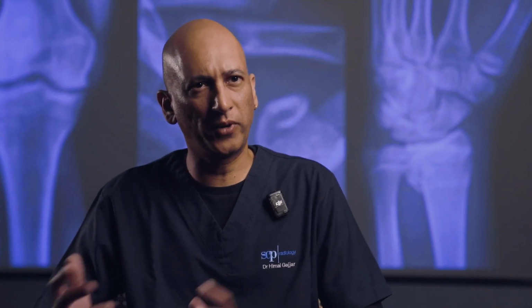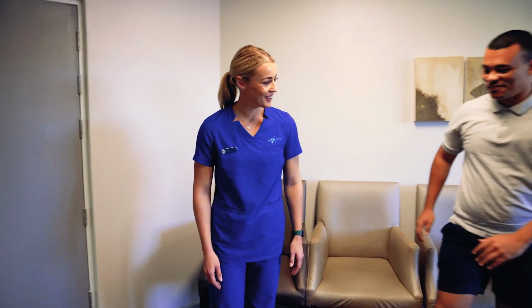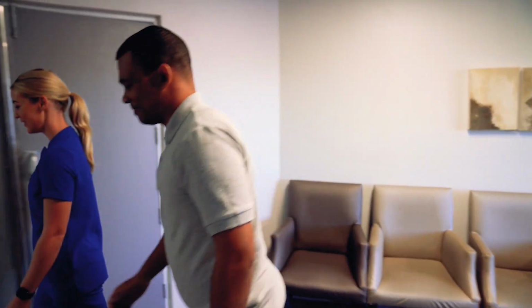The imaging of that usually starts with an X-ray to exclude a fracture. Sometimes we can see some bony changes that suggest that there is a ligament injury, although obviously X-rays don't show the ligaments directly. And we may see fluid in the joint or swelling or edema, which suggests that there is significant injury to the knee. So MR is the gold standard for imaging when one suspects an ACL or anterior cruciate ligament tear.